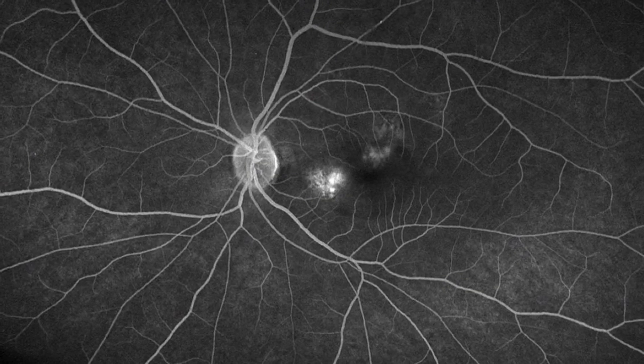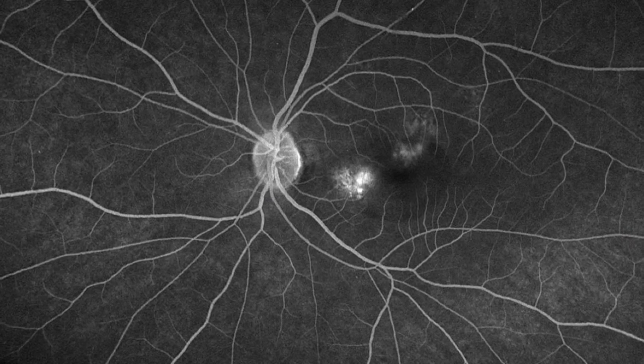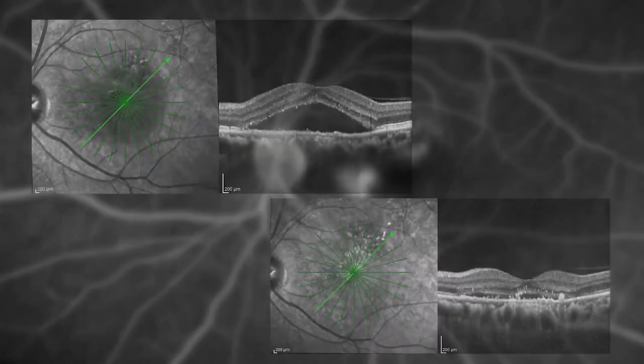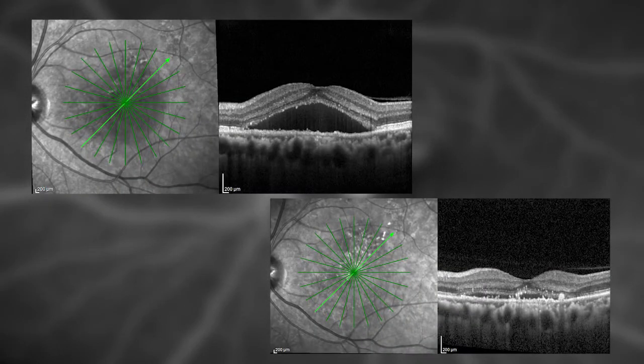This is the fluorescein angiogram of one of my patients with central serous, showing two areas of leakage in the macula that I treated confluently using low power mode. On OCT, there is resolution of subretinal fluid one month after treatment using the yellow laser low power mode.